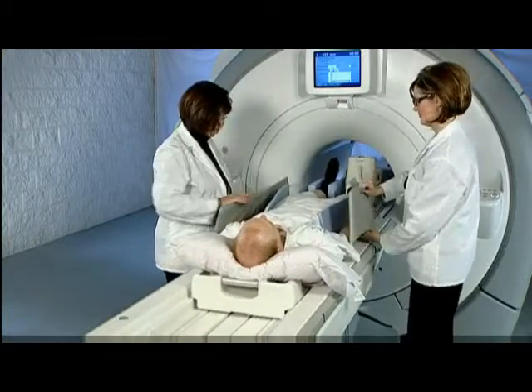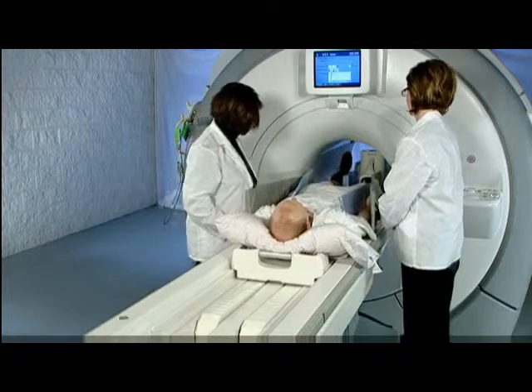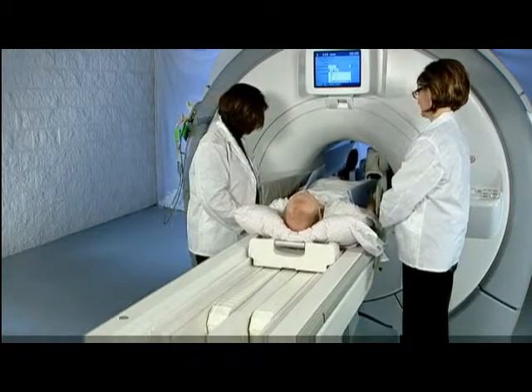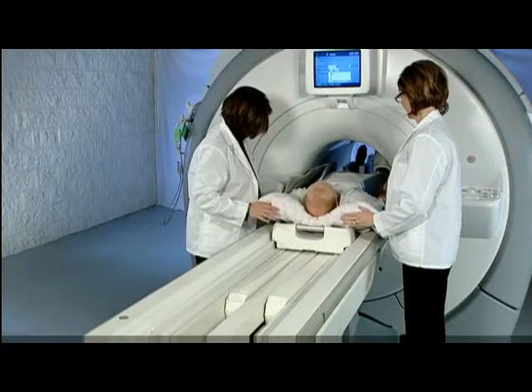Just as you saw with the whole body RF padding demonstration, you'll need to make certain that the patient's skin does not come into contact with the scanner bore, and that padding is placed between the hands and the thighs to prevent conductive loops.